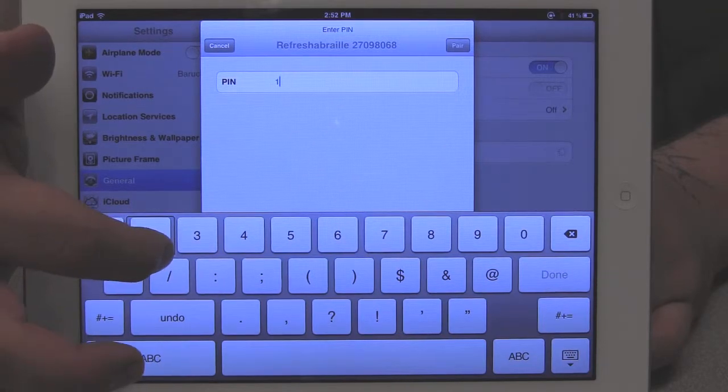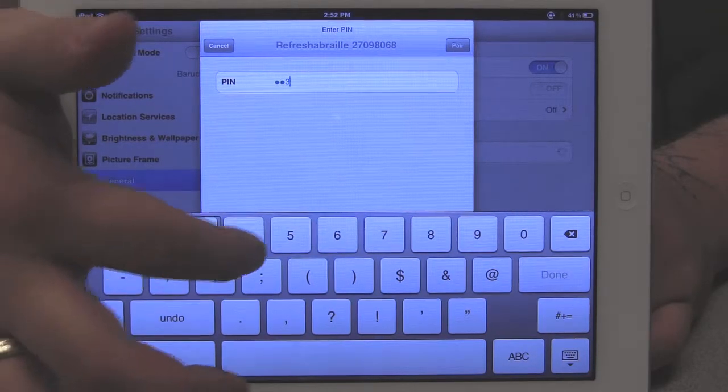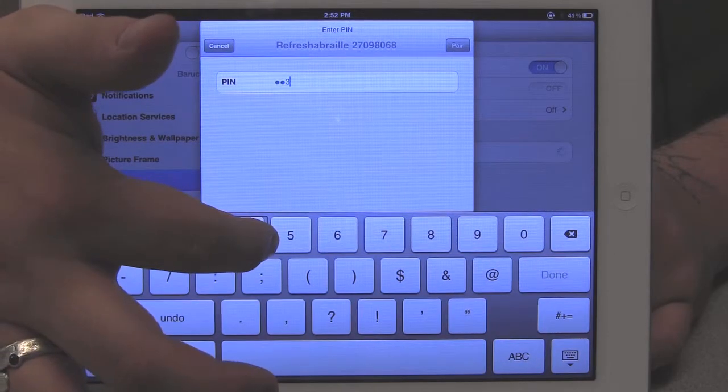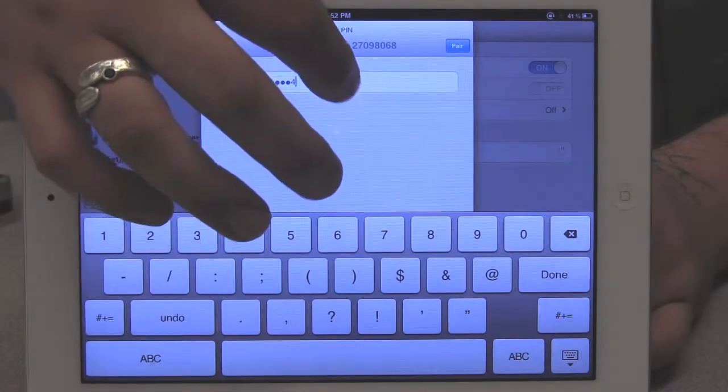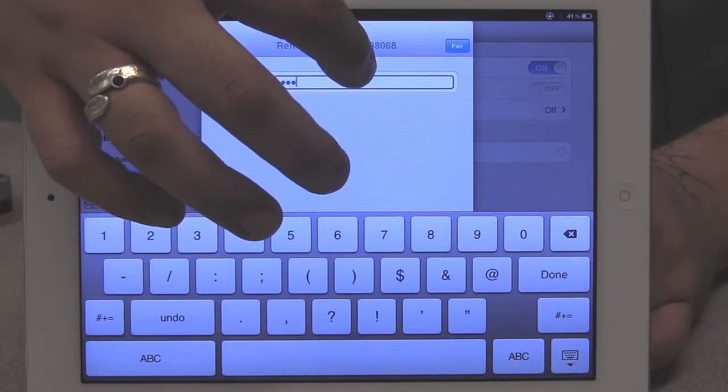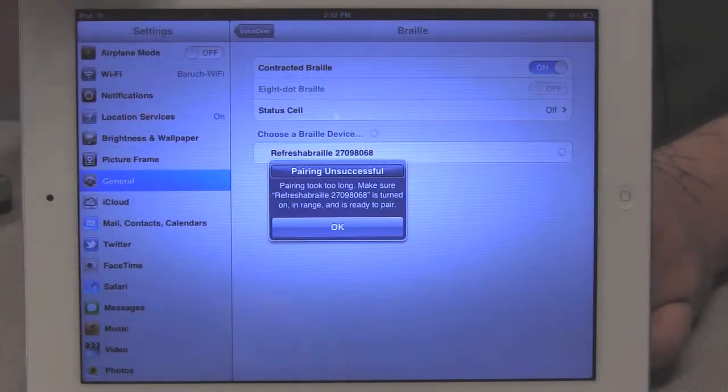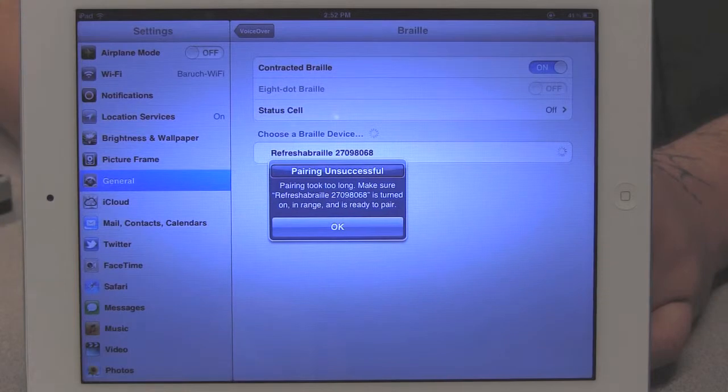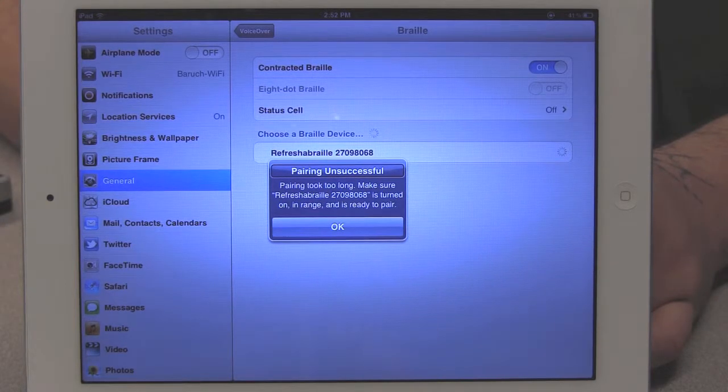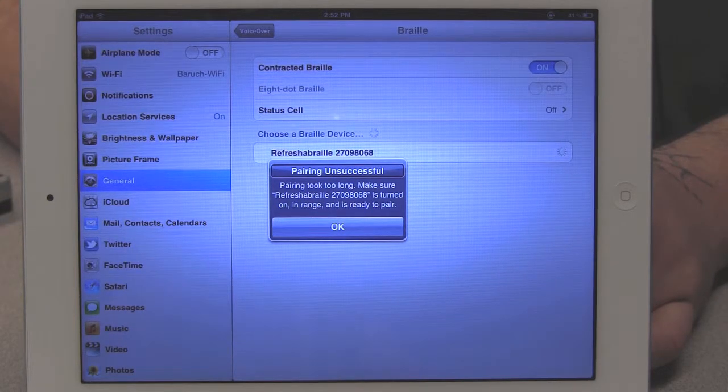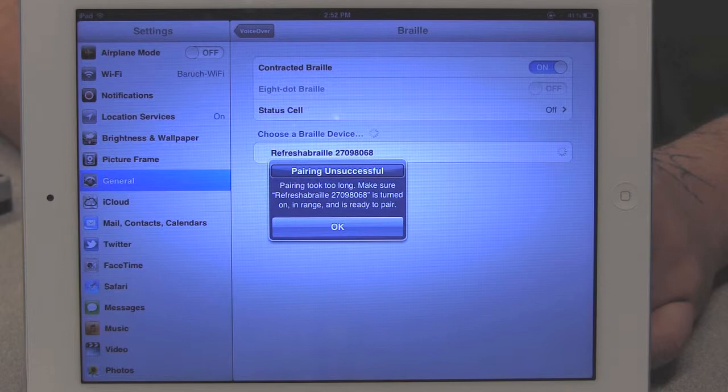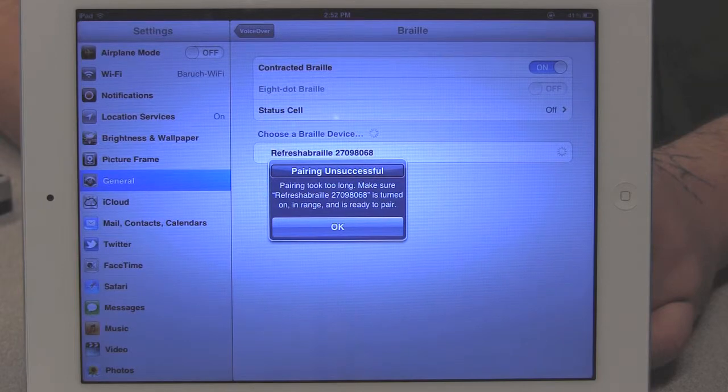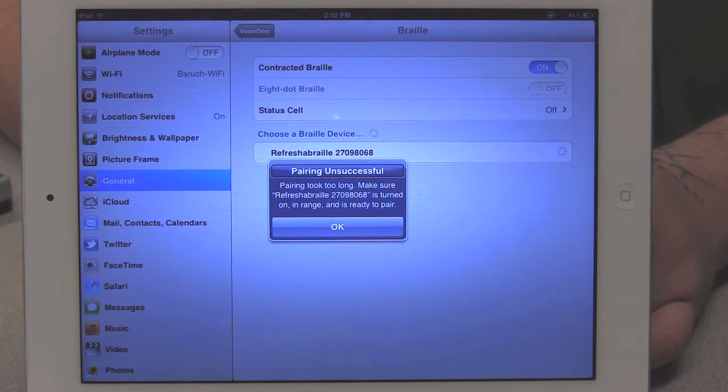One, two, three, four. PIN, secure. Alert: pairing unsuccessful, pairing took too long. Make sure Refreshable Braille is turned on, in range, and is ready to pair.